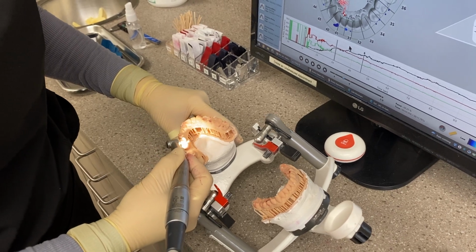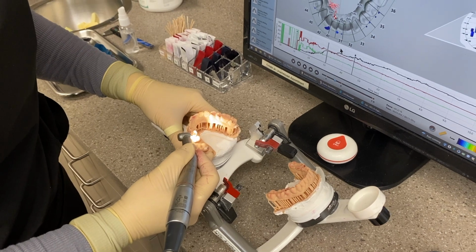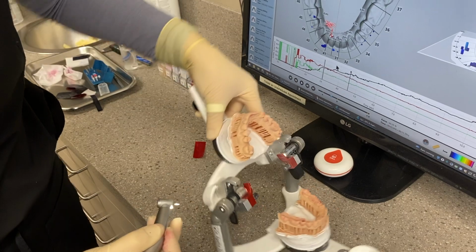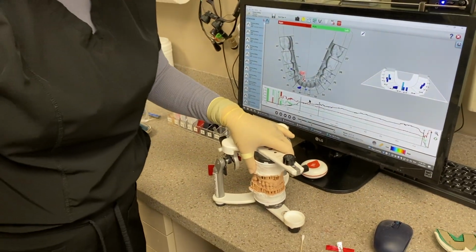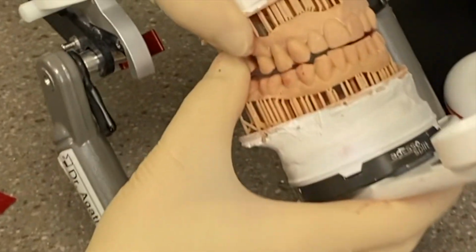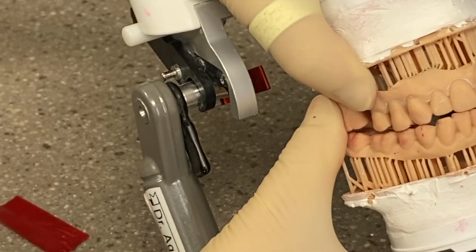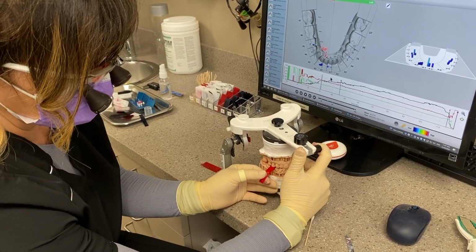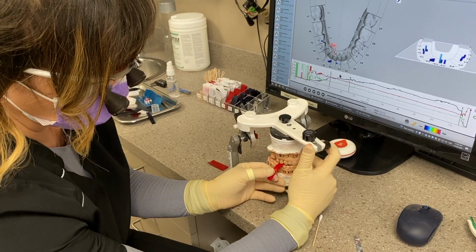The tooth is so over-erupted that I have a feeling I'm going to be through enamel and having to do some sort of a restoration. So we're getting close on the canine. If you look on the lateral movement, we're almost there on the canine. So I might be okay, and manage to get into canine rise very quickly. But definitely at this point, I've removed enough enamel that I would have to restore in some way.